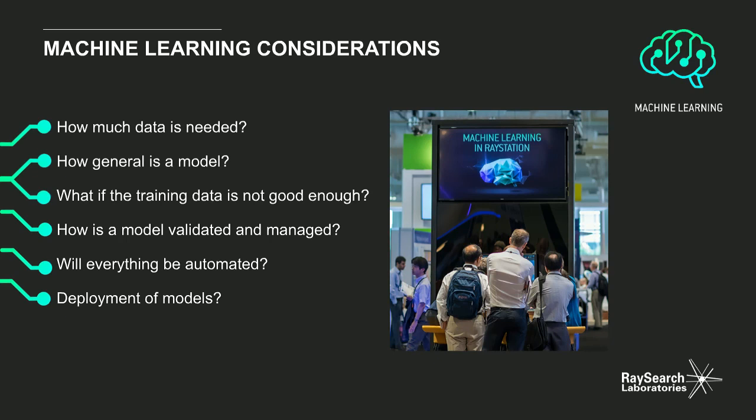And finally, deployment of models. Well, I think all the vendors should make sure that machine learning models and the deployment process facilitate that clinics can share the models between them. So it should not be tied to a release version of the software. It should be independent of that.